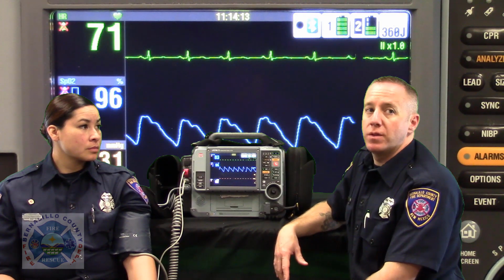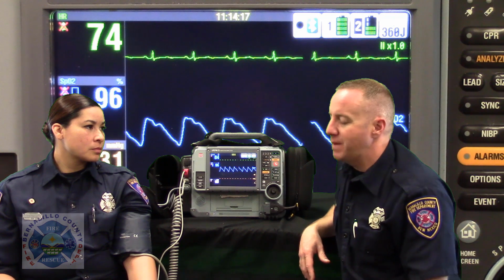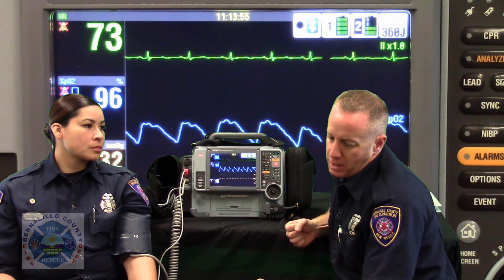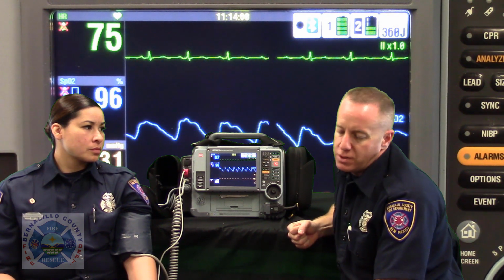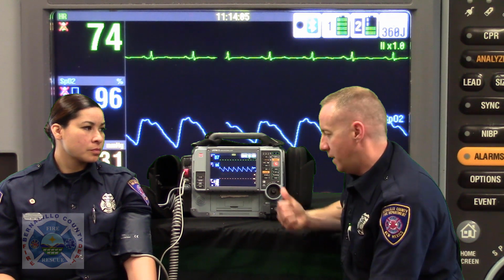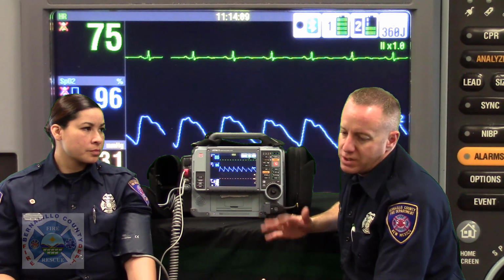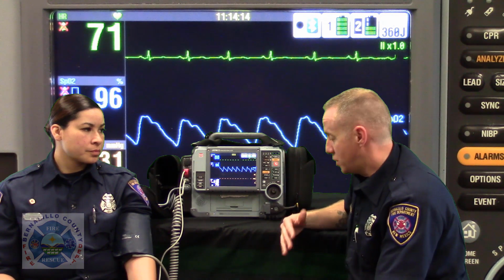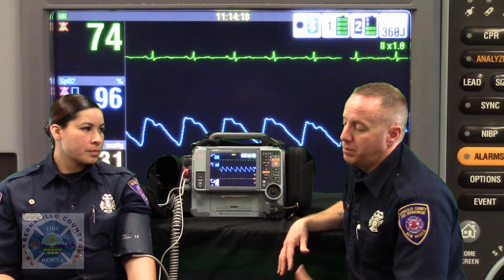Oh, I did want to add one more thing. The default inflation pressure on the LifePak is 160 millimeters of mercury. If you're doing a manual BP, you know, sometimes you'll inflate the bladder until you obliterate the pulse, so you're listening as you're inflating and also listening as you're deflating. This one's just going to inflate to 160 on the first attempt. If it registers that the patient's blood pressure is higher than that, then it'll inflate a second time to 180 or 200, and that's going to take a long time to get a blood pressure reading.